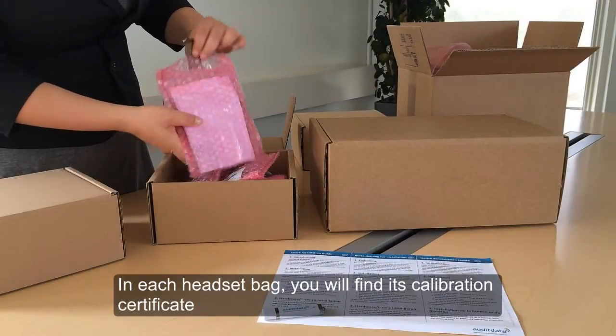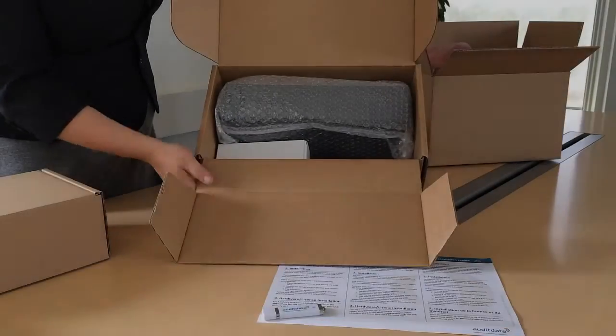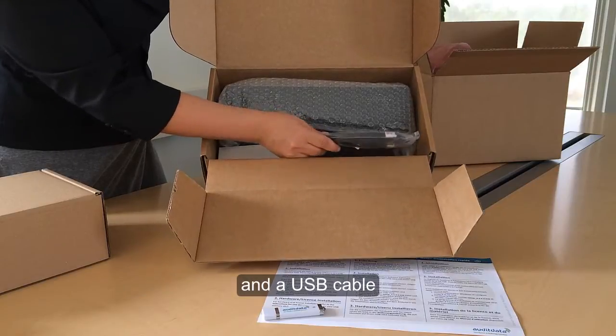You'll find a calibration certificate for each transducer that you have ordered. Each certificate is packed with the corresponding transducer. The fitting unit will be delivered with country-specific power plugs and a USB cable.